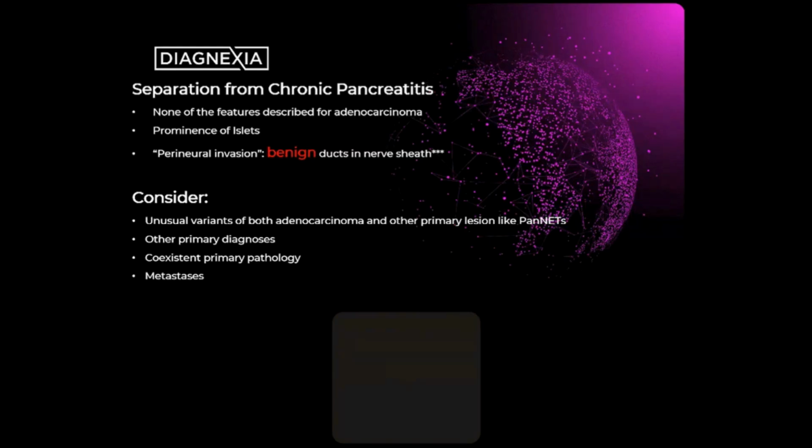And remember, metastasis, even if clinically unsuspected. I've seen cases where the pancreas frozen section came in as query adenocarcinoma pancreas, and it turned out to be a metastatic melanoma. So again, knowing the clinical history helps. In this particular case that I mentioned, there was no history of a melanoma. The patient had a melanoma removed 25 years previously.